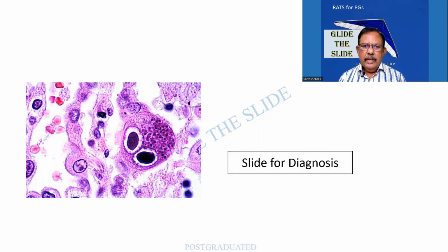Last class, we had given you a homework. It was a simple slide for diagnosis. And I hope you people have made the diagnosis or at least a differential. Nevertheless, let us see what is on the screen.